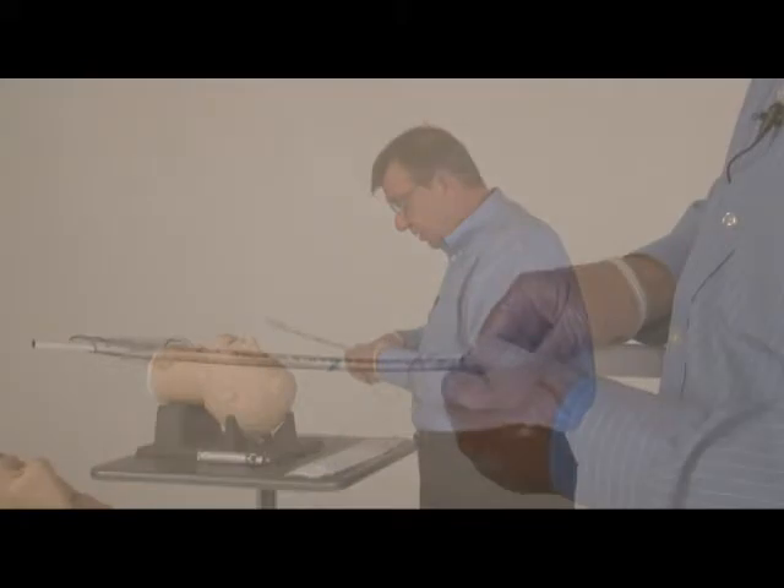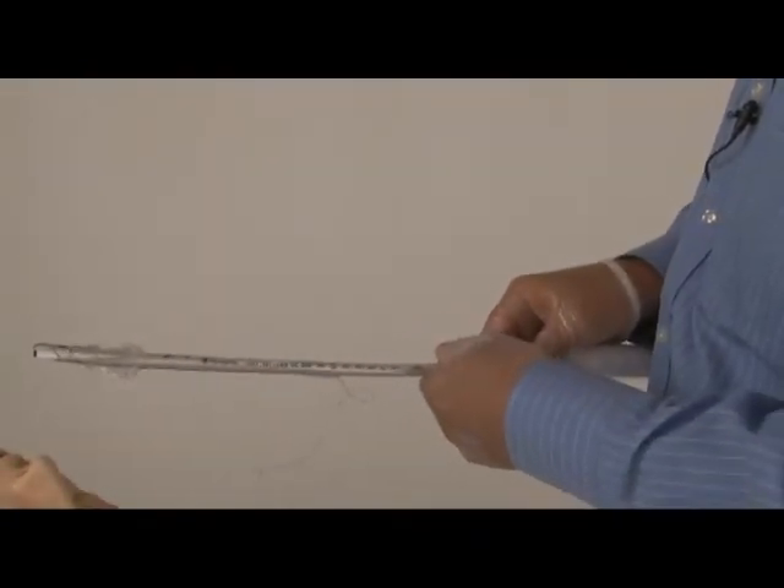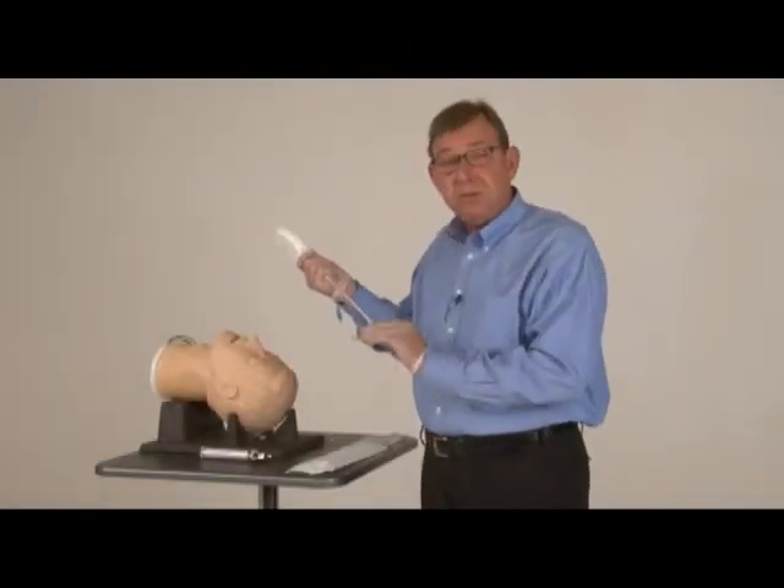You use the stopper to secure it at the appropriate length so the camera is just right at the end of the tube. And then lubricate around the balloon to make it easier to pass through the cords.